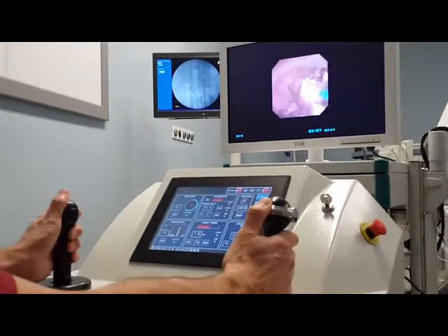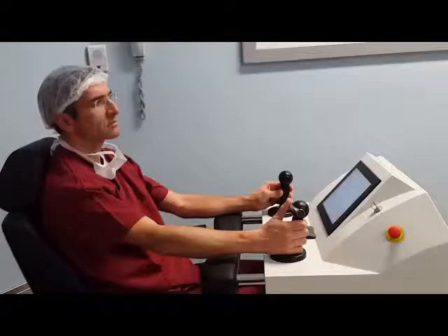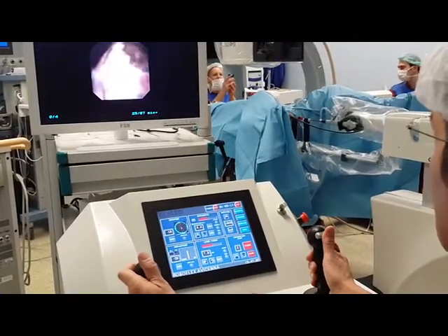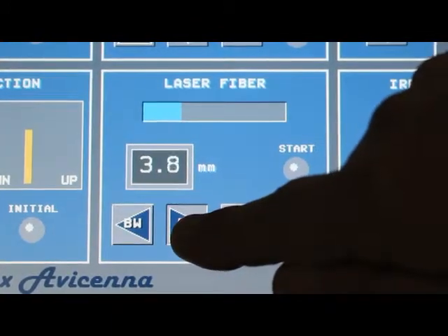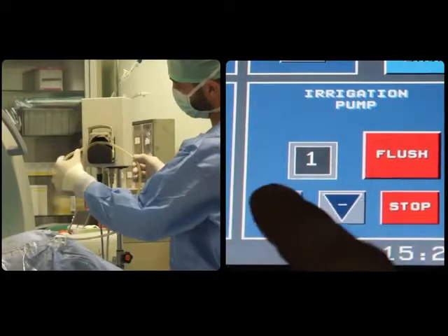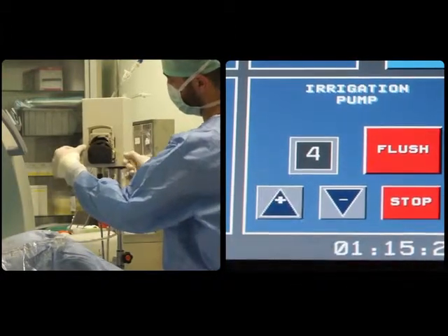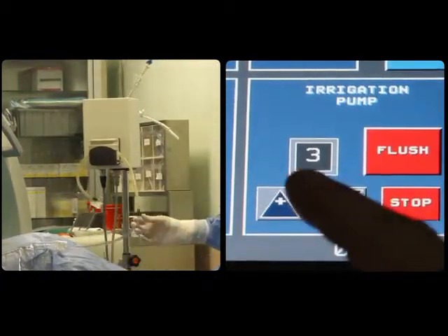Once the stone is visualized endoscopically, intracorporeal laser lithotripsy can be initiated, preferably aimed at dusting the stone. Through precise rotation and deflection of the scope, the laser fiber can be remotely moved in and out. The integrated water pump can also be adjusted to increase or decrease the flow rate for optimal endoscopic vision, and low pressure flushing is also possible.